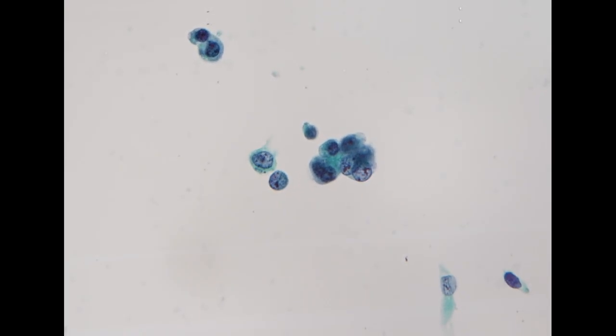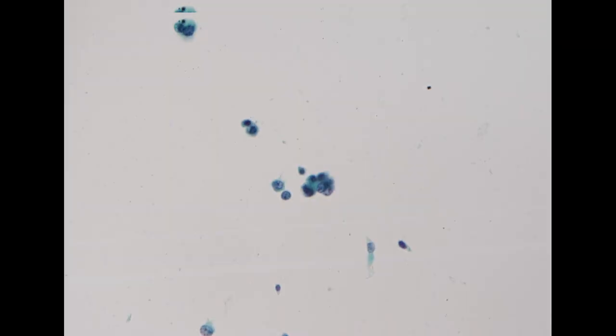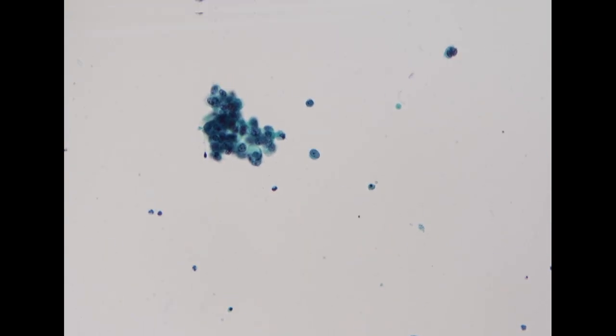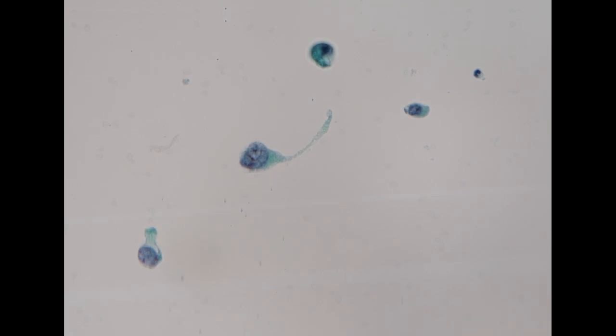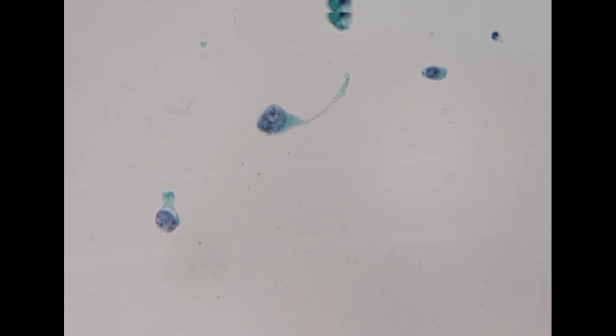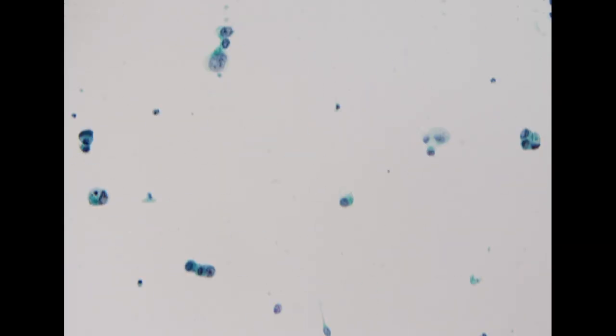So this is one of the uncommon patterns that we can see in high-grade urothelial carcinoma. Sometimes we see most of the lesional cells showing diffuse hypochromasia, but they still maintain other features, including increased NC ratio, increased size of the nucleus, as well as irregular chromatin pattern. And so high NC ratio and large nuclei are diagnostic features.